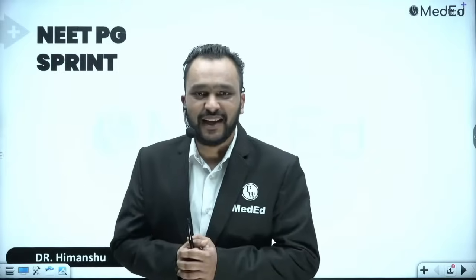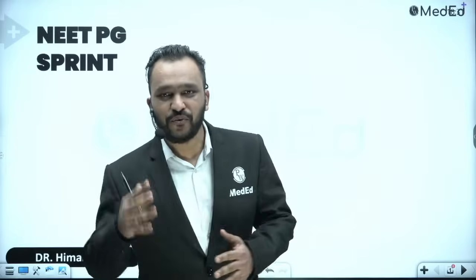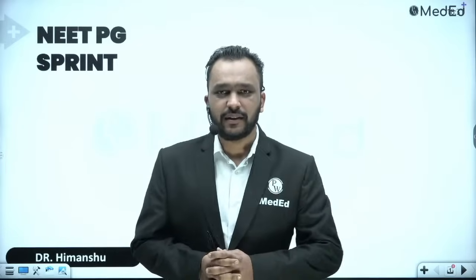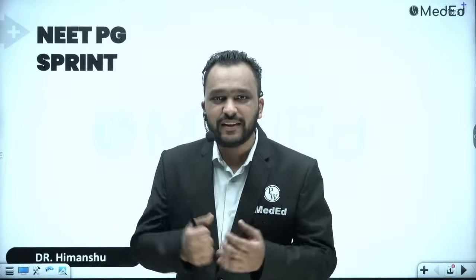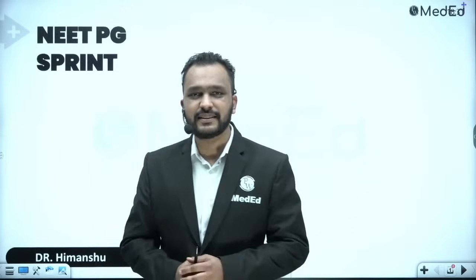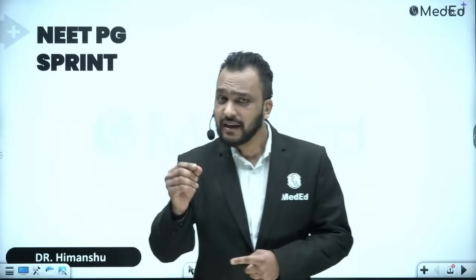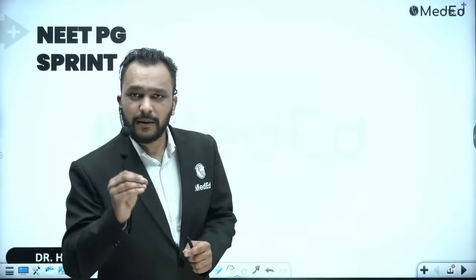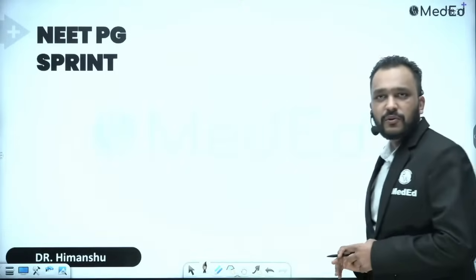So today in this live lecture, guys, we are going to revise the whole of radiology in just 4 hours, right? I will be showing you images and you have to try to look at the images and identify the findings. After identifying the findings, just put your answers in the chat section. Also, you can download the PDF which is available on our Telegram group, and you can make notes along with the lecture, right? So let us begin, guys.